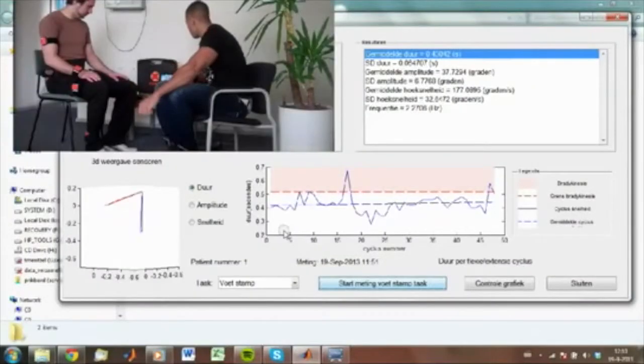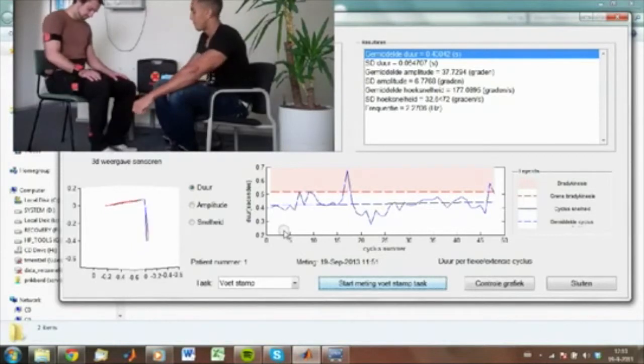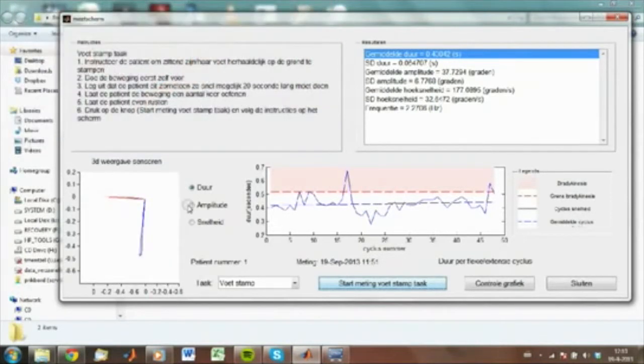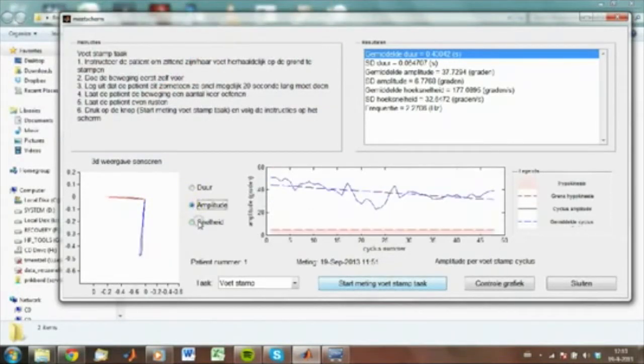The third task is raising and stamping of the foot. The patient has to lift up the foot from the floor. You see the movement again on the monitor — the duration, the amplitude, and the speed.